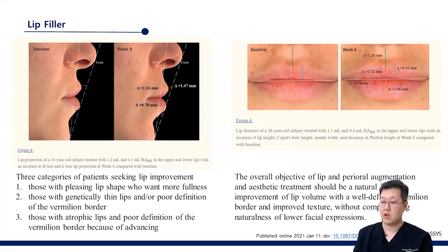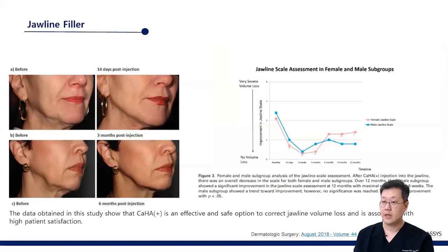So today we have a beautiful candidate, and we will show you which points will make her more beautiful. Usually, when the patient's skin is more sagged, we can see that the jawline is also problematic. But if you use only jawline filler, the skin will not be tightened, and if you overcompensate with jawline fillers, we usually don't get a good result.